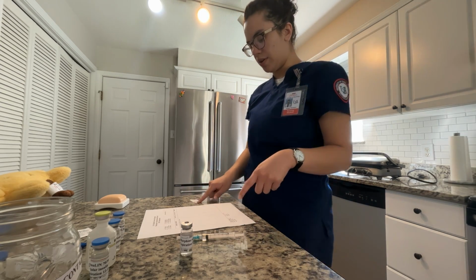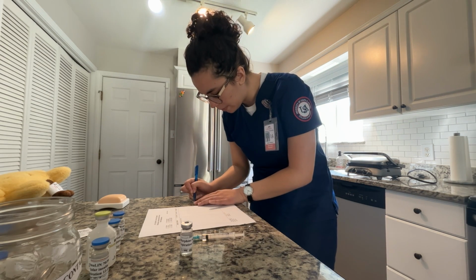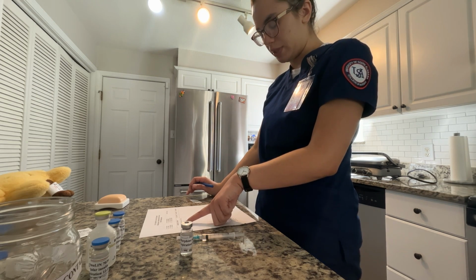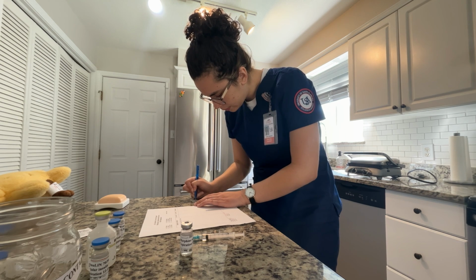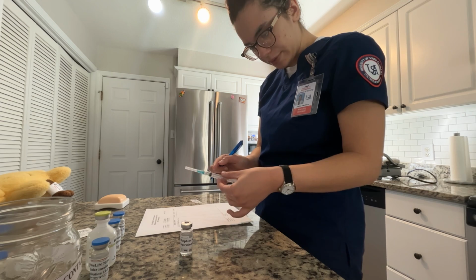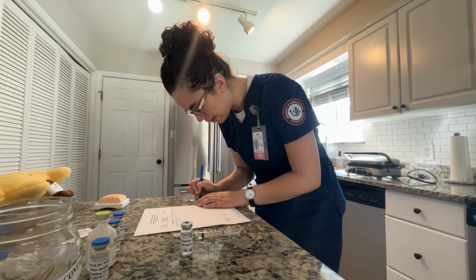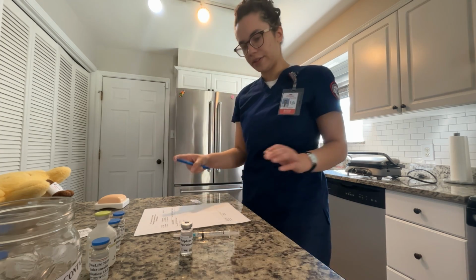So on this label, I'm going to write Jaguar J. Jones. I'm getting this information straight from my MAR. I'm also going to write the drug, which is morphine sulfate. And then I'm also going to write the dose that he is getting, which is 5 milligrams. So I had to draw 0.5 milliliters into my syringe, since I had to convert from milligrams to milliliters. So I'm going to write 5 milligrams per 0.5 milliliters.